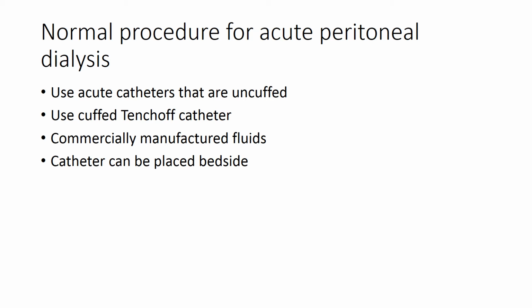So now we're here talking about improvised peritoneal dialysis. What that means is that these things that we have listed are not available. So then what do we do? Do you watch somebody die from renal failure? Obviously not. At least in our unit, we prefer not to just look at people dying from something that can be treated. So what are the options?